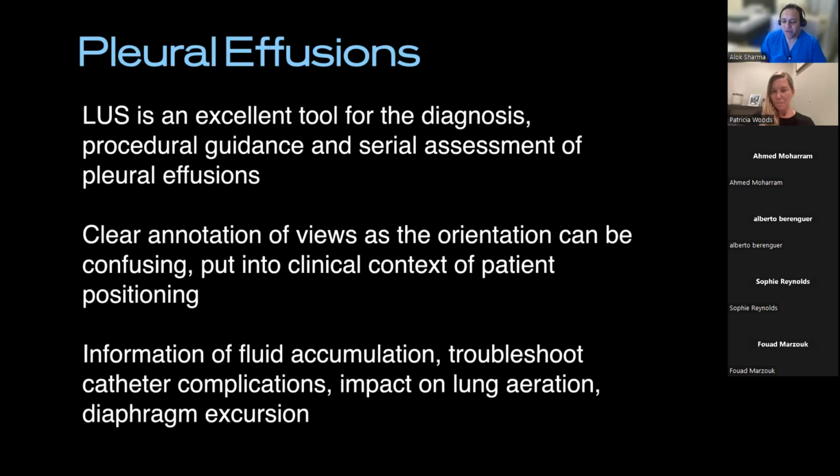I think one of the important aspects is making sure that when you document it, and especially if you're getting somebody else to do those serial measurements, you document which intercostal space you did your measurements in, so that for continuity you have that serial follow-up. Yeah, that's an excellent point. And when you're scanning, making sure that your area of interest, ideally in principle, is midway through the transducer, if you can, and annotating and doing that in a consecutive way, consistently, is important.